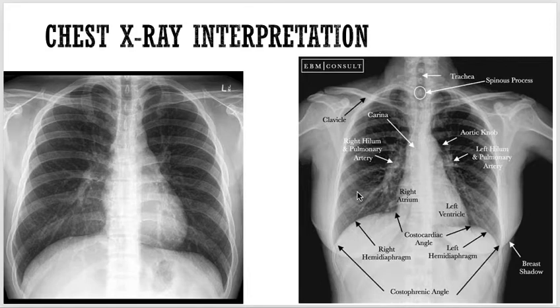Okay. Now, what to assess in the lungs? In the lungs, you have to assess the size and any pathology you can see inside the lungs, like tumors, or in the apex if you can see some shadows or things like this, and always see the hilum. Okay. How to assess the pleura? Maybe in the pleura you will find some calcification, some thickening, or maybe you will find some fluid or air over here in the case of pneumothorax.